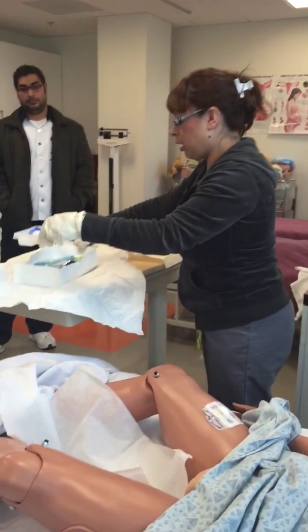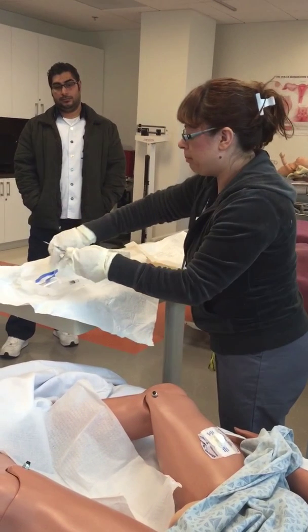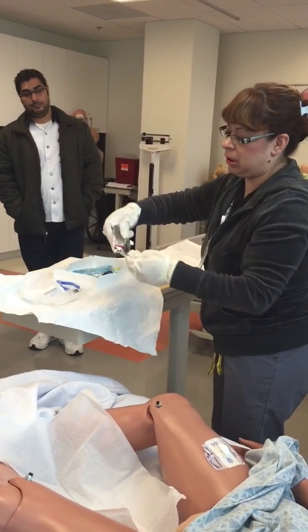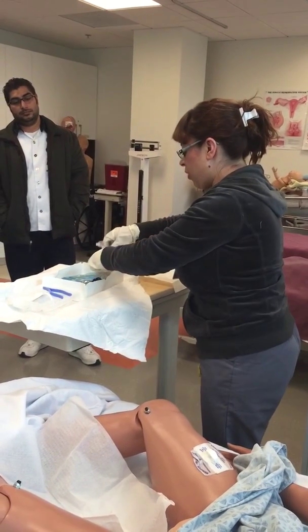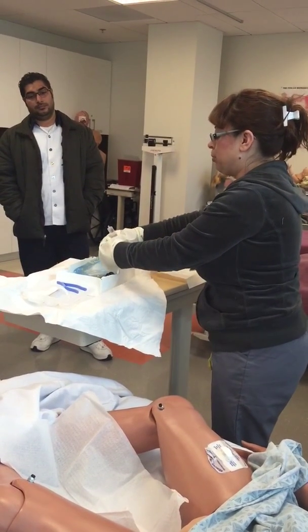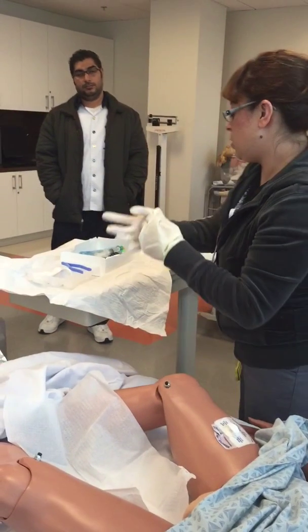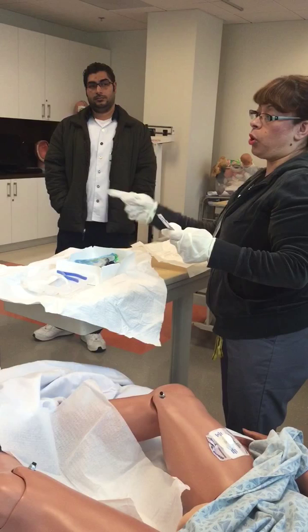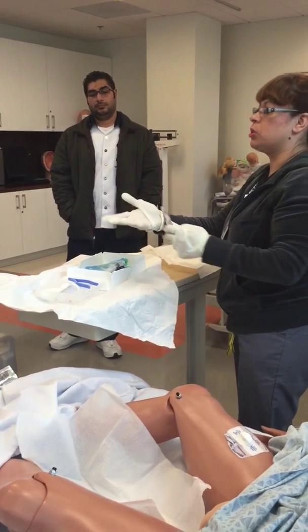Now I'm going to get my kit ready here. Separate these two containers. Grab my betadine, open it, pour it over my cotton balls. It's a good idea to spread your cotton balls so they're not stuck when you start cleaning the patient. Throw that away. I'm going to attach this to my catheter. Depending on the kit you use, most catheters these days do not want you to pre-test your balloon. This is the one I use at my place. We don't pre-test; they say you actually cause more harm than good by pre-testing. They have already been pre-tested in the factory before coming to you, so there's really no need.